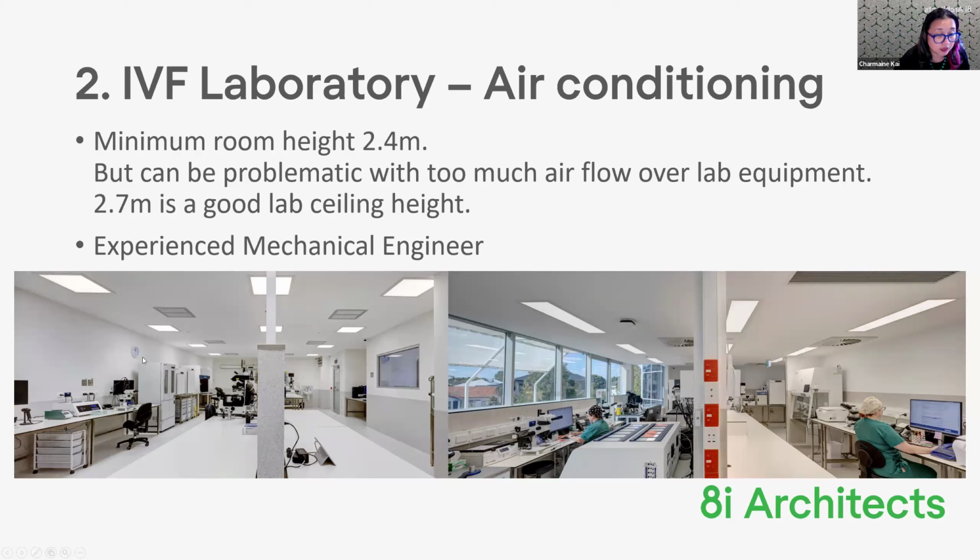You can do ICSI, you can do your sperm prep, you can do your egg prep on the benches without much worry, because you're not going to end up with a lot of air blowing over your work environment, and it's not going to blow air onto the staff either. So that's really important in terms of even just the layout of where the air conditioning registers go.